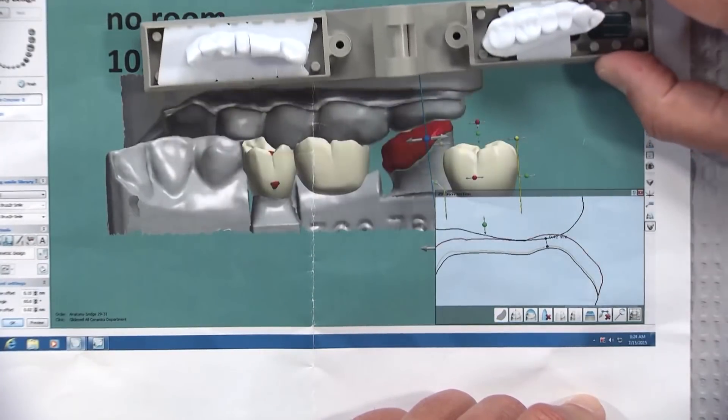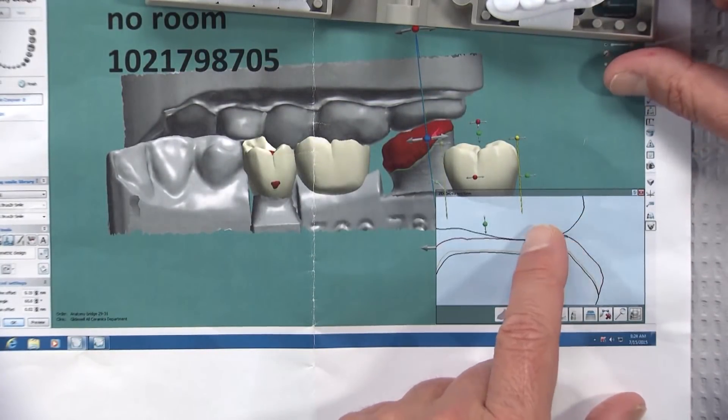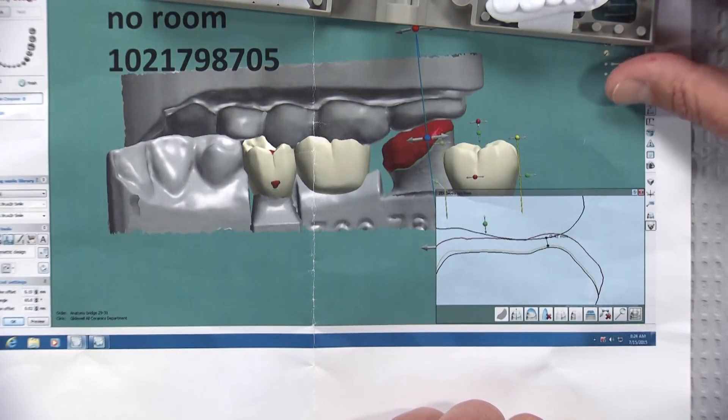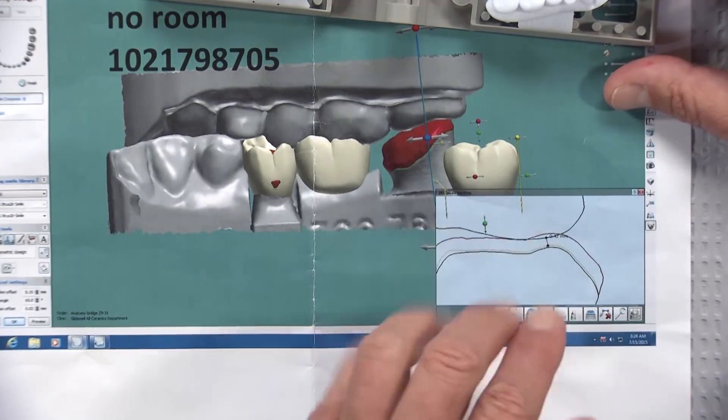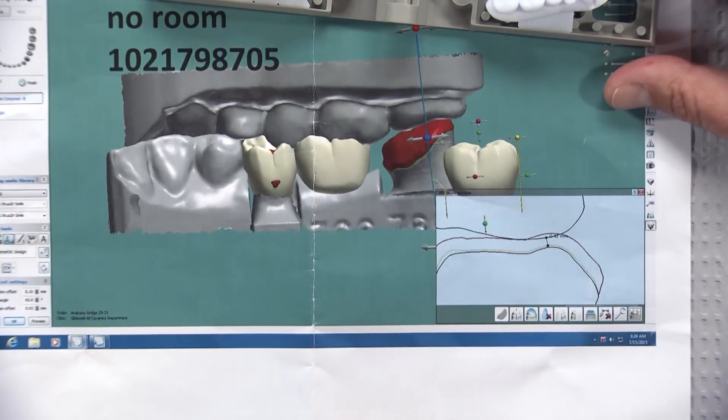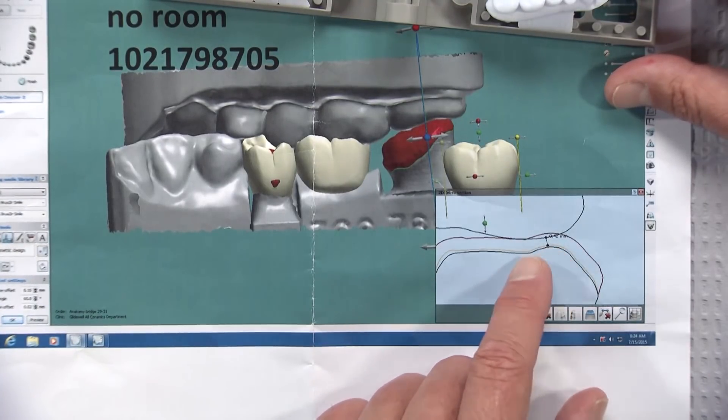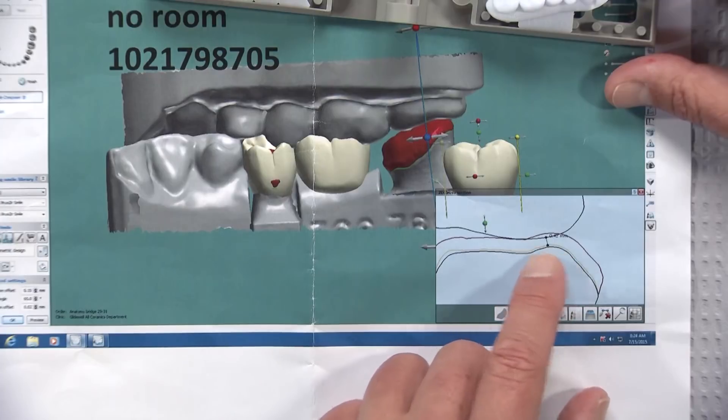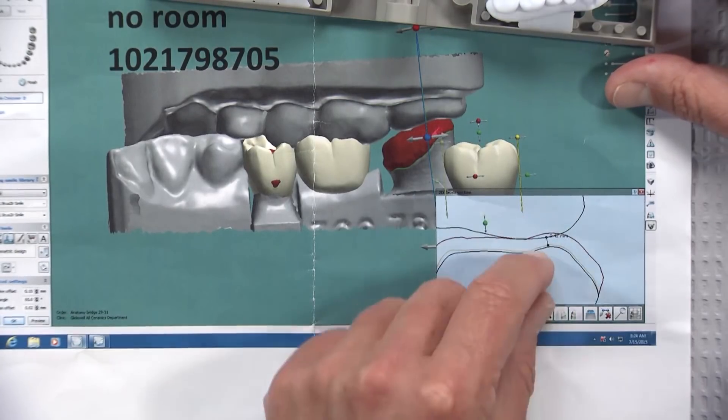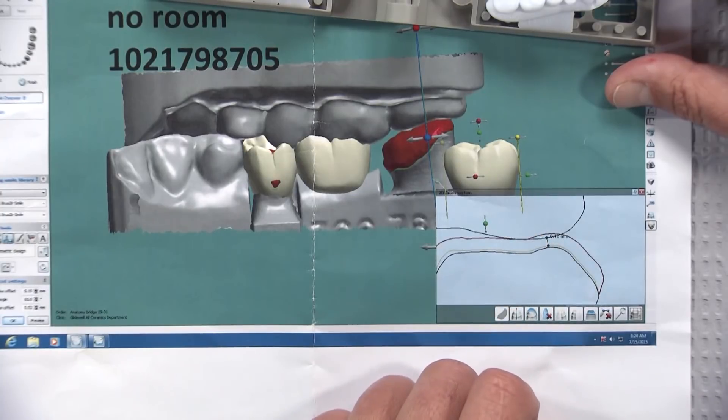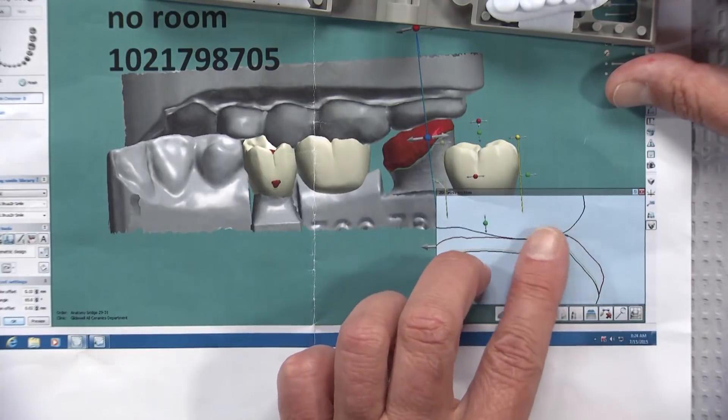As a result, he sent this to us and paid to have the model printed even though we don't have enough room here. When you can see this amount of under-reduction chairside while the patient's there and the patient's numb, this allows you to go back in and prep more on the tooth or prep on the opposing tooth if you wish, and then grab another image right here and be able to see whether or not you've accomplished the adequate reduction.